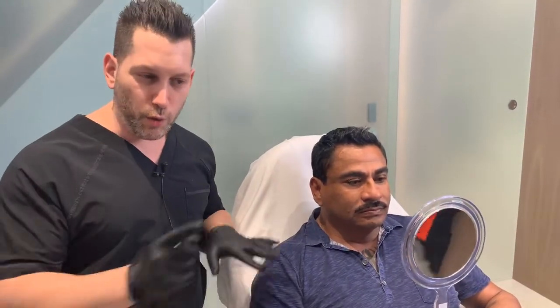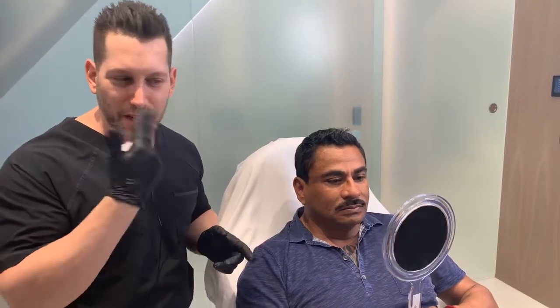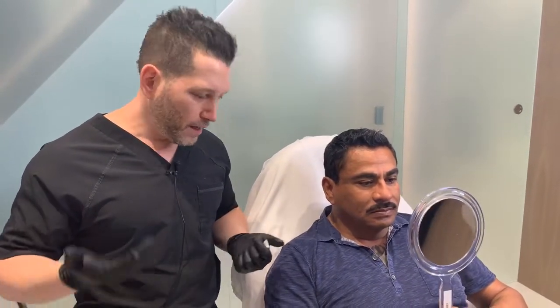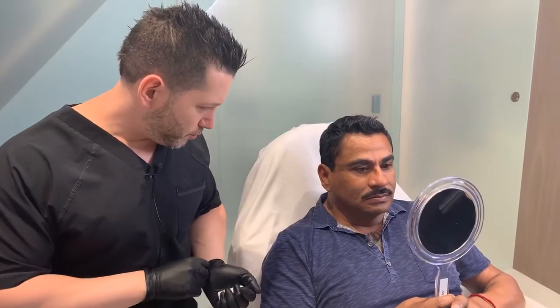Overall, the other thing is no one would look at him as a man and think he had anything done there. 3 syringes of Restylane, giving him a nice improvement around the mouth. It's going to make him have support, give him a long-term 1 to 2 year improvement there. So I think we're successful.